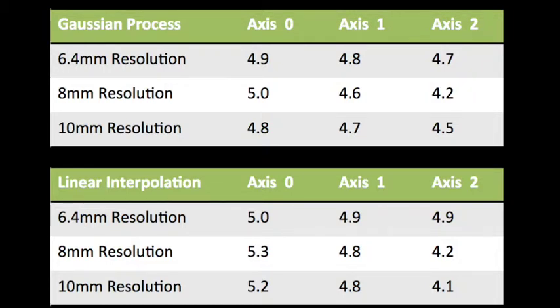In general, for movements along these 2 axes with heavier noise, we can use lower resolution volumes to accurately detect motion, which achieves our goal of reducing time intervals during the scan. However, Gaussian process does not work so well for the volumes that have lower noise due to overfitting, and in this case, linear interpolation suffices.